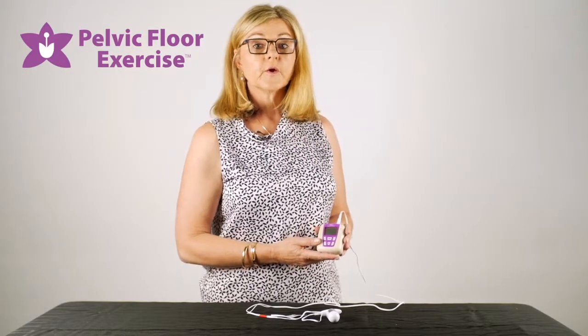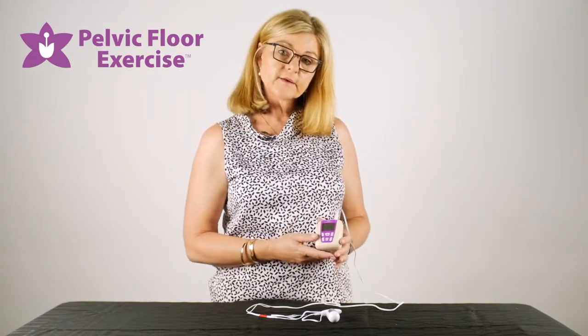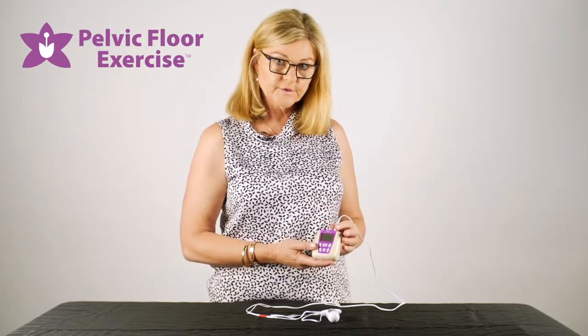Hi, I'm Fiona the physio from pelvicfloorexercise.com.au and today we're going to have a quick look at how to set up your Pericarm and how to use it.